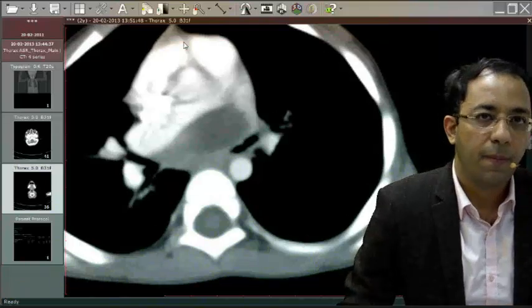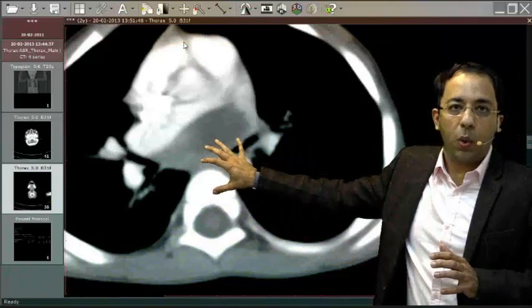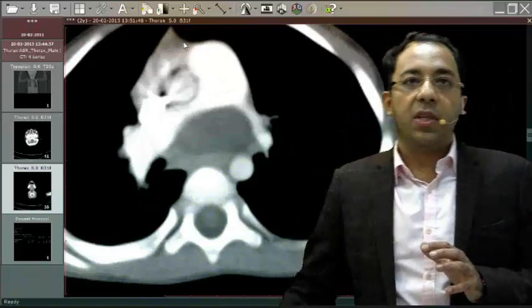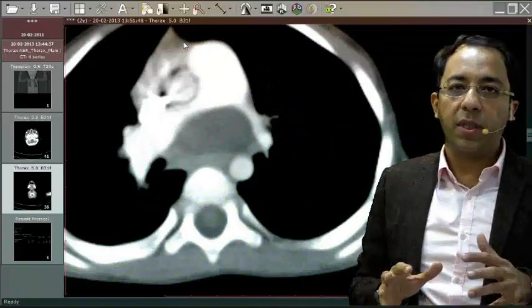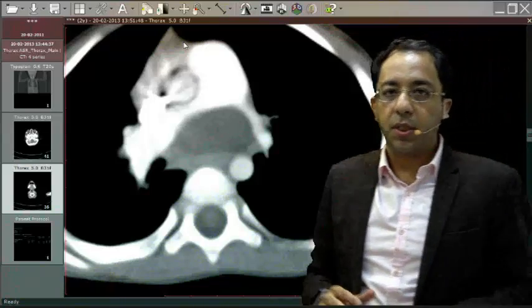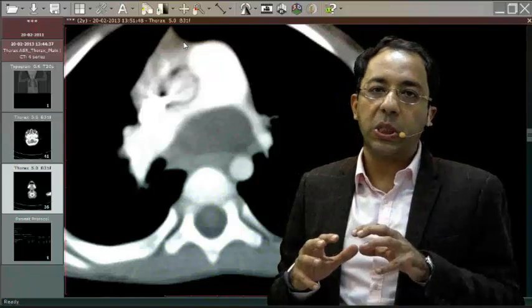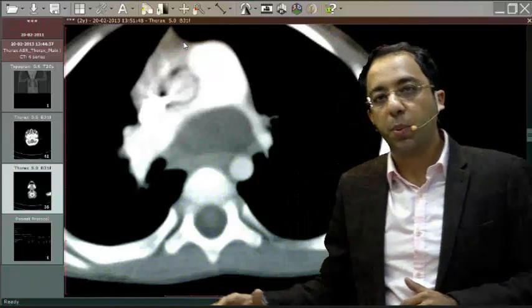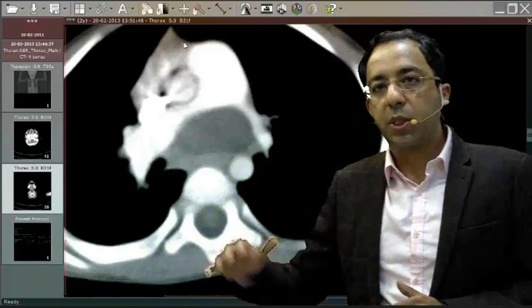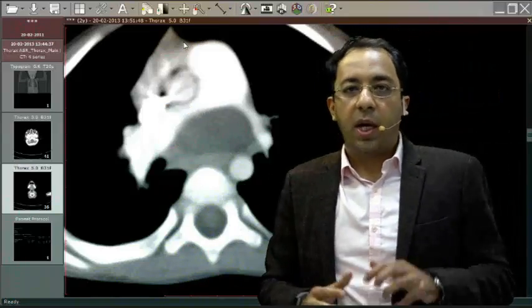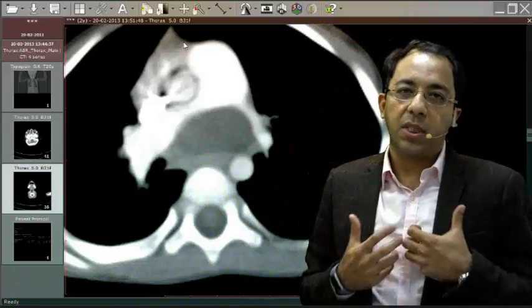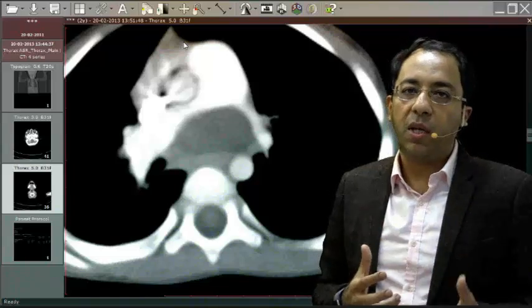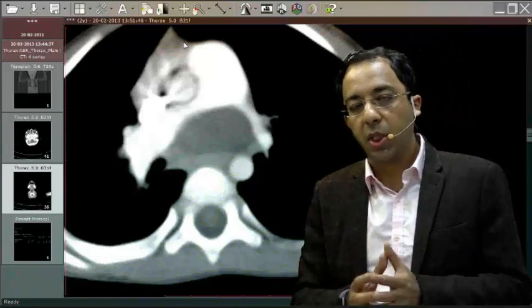Let's try to trace out the left bronchus. This is where you have the left bronchus and it looks as if the left bronchus, even the pulmonary bifurcation, appears stretched by the cystic lesion. So probably we are dealing with a cystic lesion sitting at the carina which is stretching the left bronchus, probably partially obstructing it. Maybe that partial obstruction is explaining the hyperinflation of the lung that we saw, and that stretching of the pulmonary artery again reflects the nature of the cystic lesion. It may be that we are dealing with a cystic lesion which is under some tension.